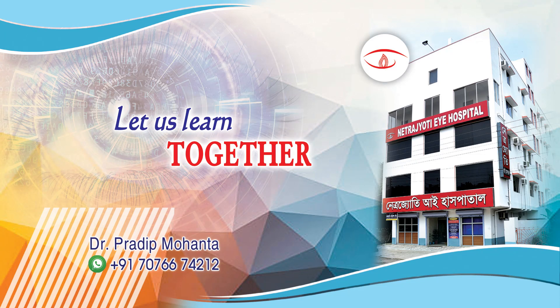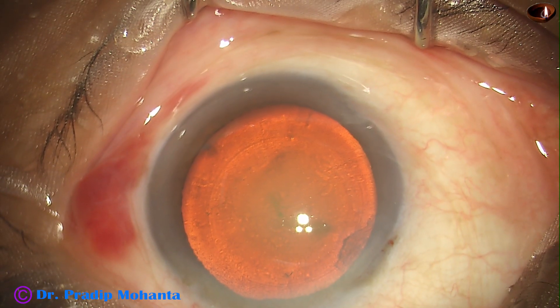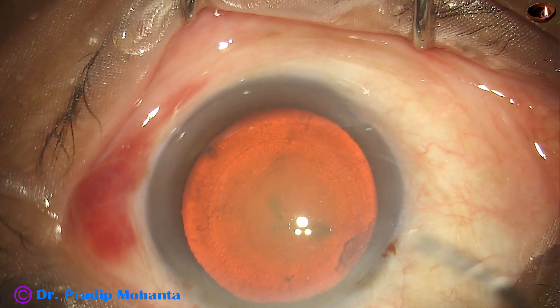Friends, welcome to my workplace at Ranaghat, West Bengal, India. This is a cataract with grade 3 nuclear sclerosis. Let us observe this surgery.